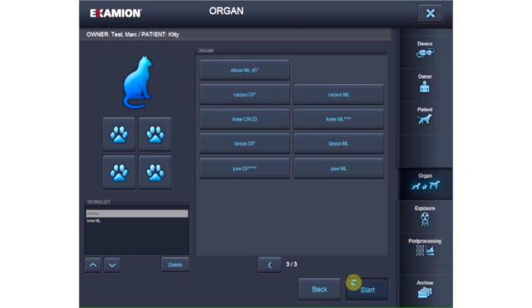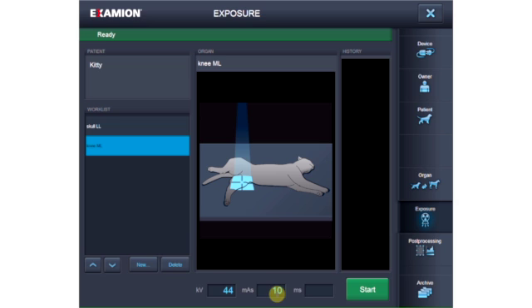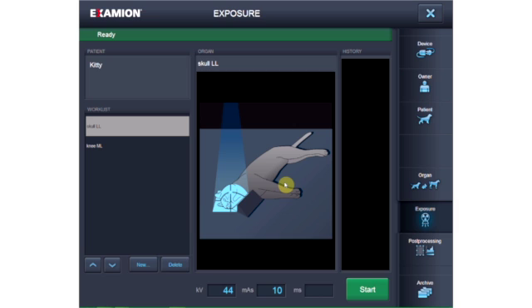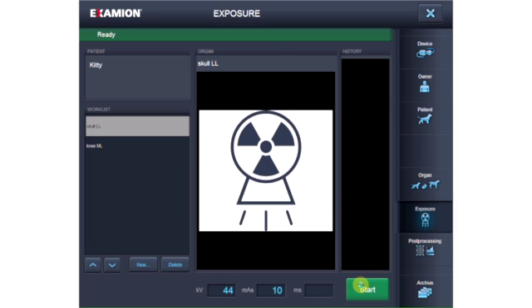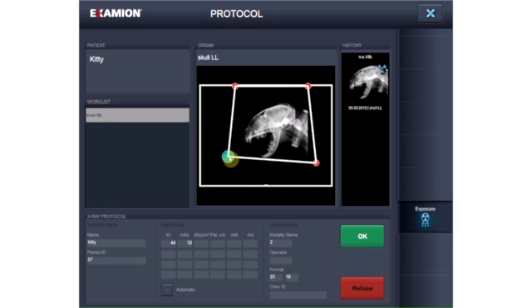The exposure parameters automatically created by the generator can be changed manually. The history of the exposures taken is located on the right-hand side of the screen. The final processed image is displayed within a few seconds after exposure. The shutter is set automatically and you can adjust it manually.